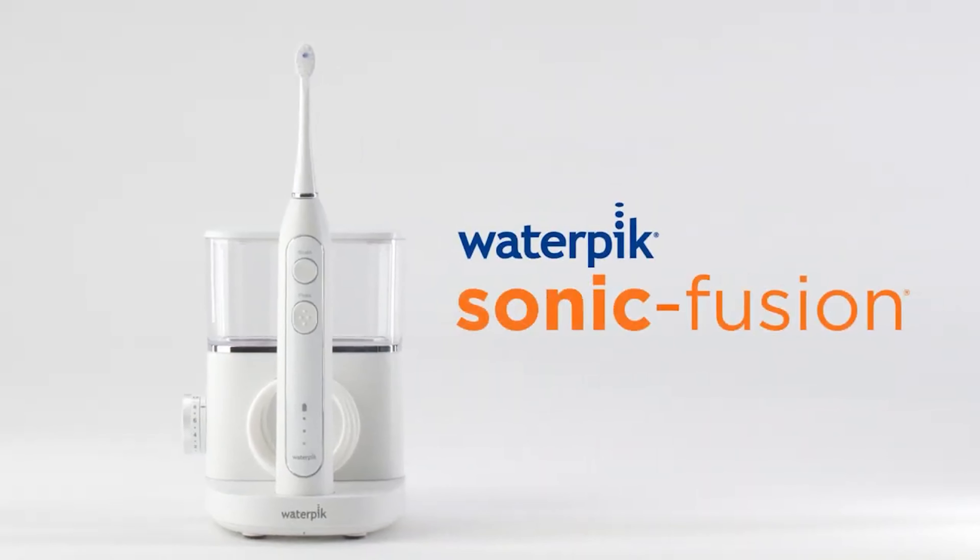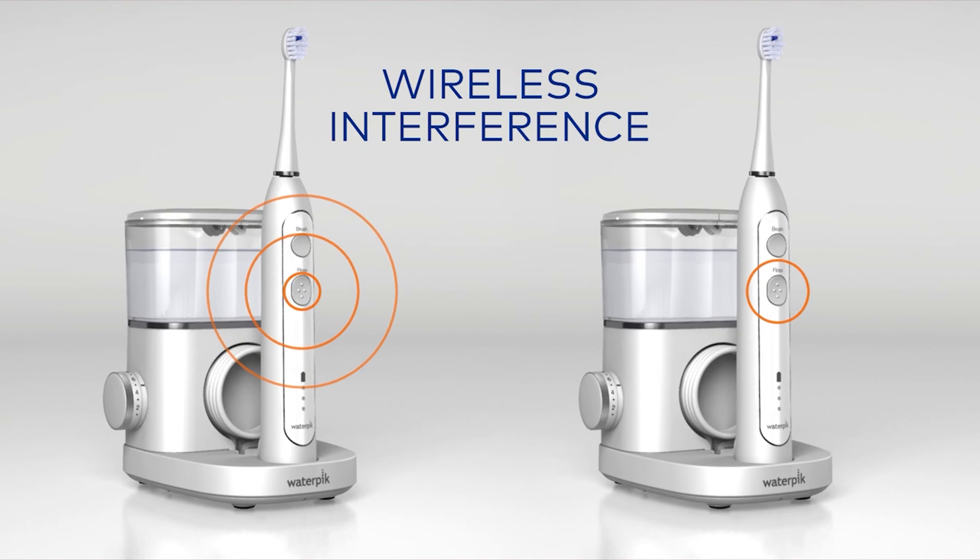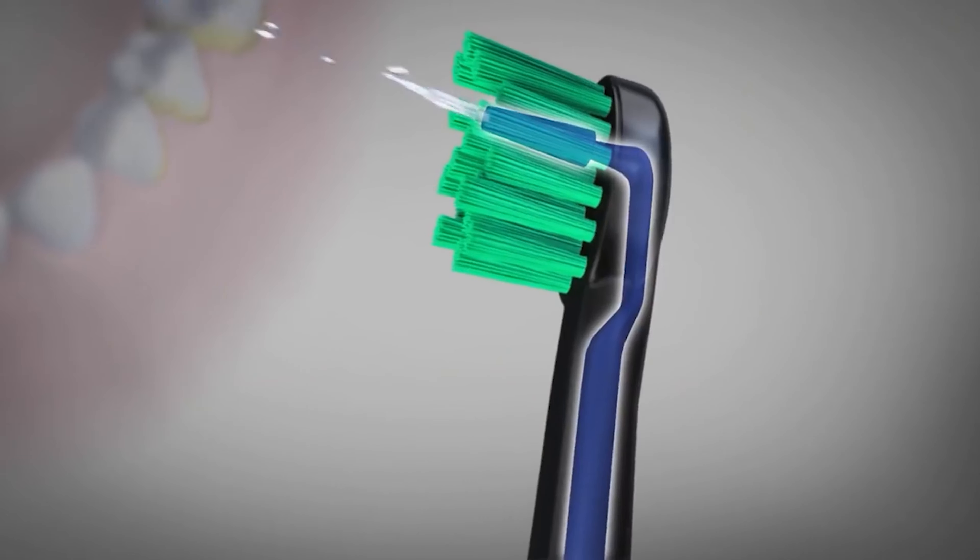In this Waterpik Sonic Fusion review I'm going to be giving you some insight into this new unique technology that can help you clean your teeth more quickly and easily, and help you to maintain a higher level of dental hygiene with less effort.